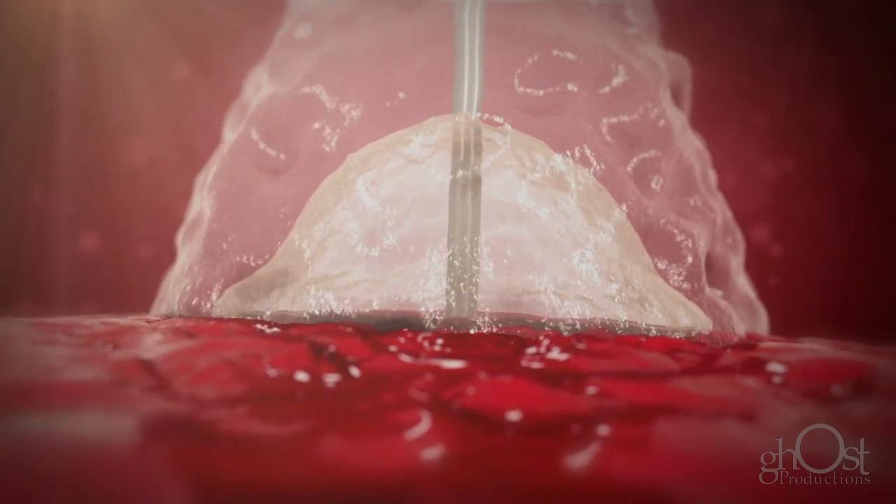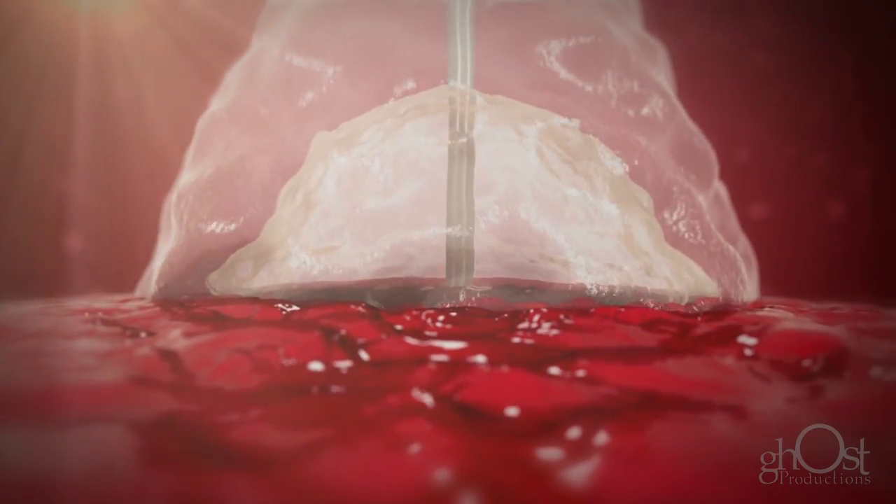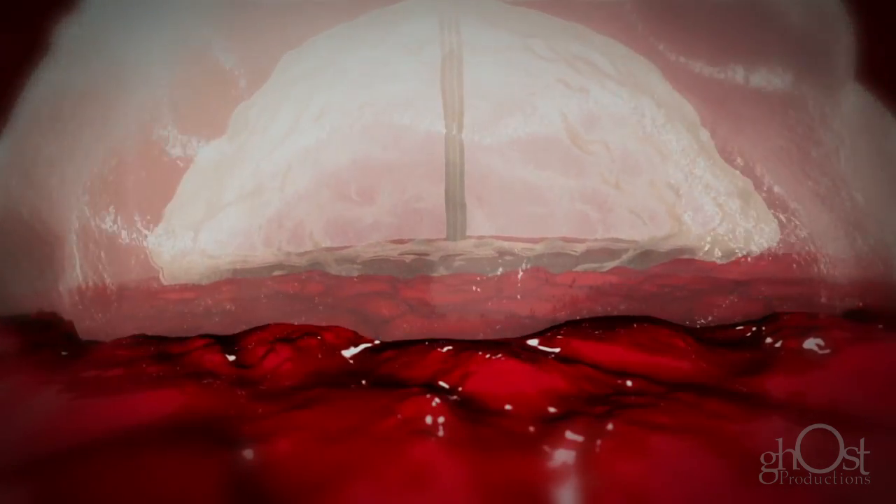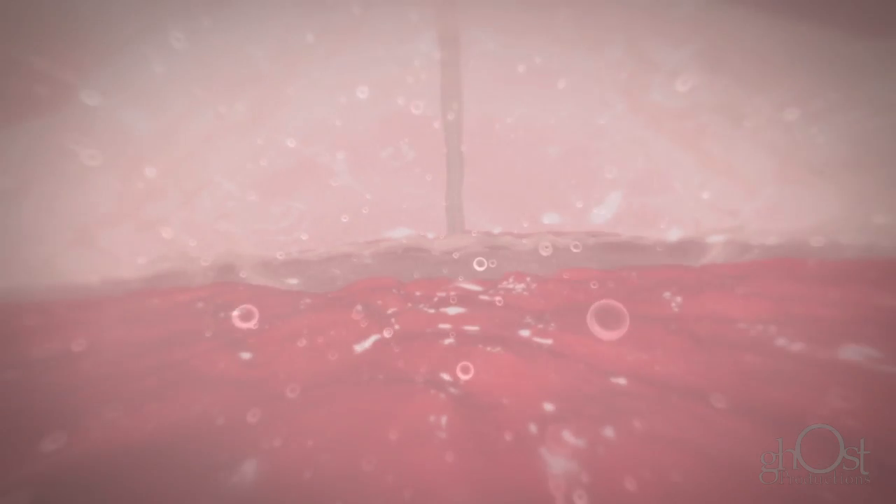Minx Ace includes grip technology, which actively adheres to the artery. It softens and interlocks with the contours of the vessel wall, gripping the artery to provide a secure closure.